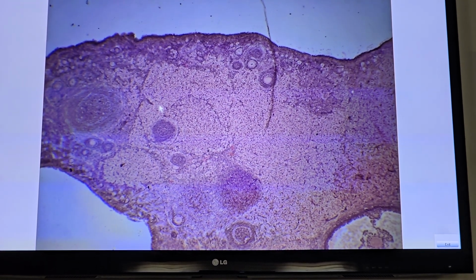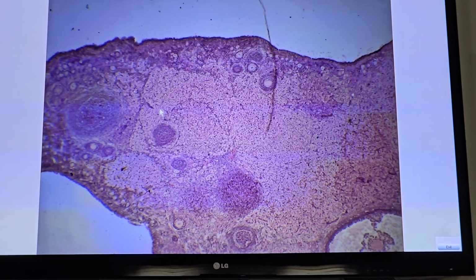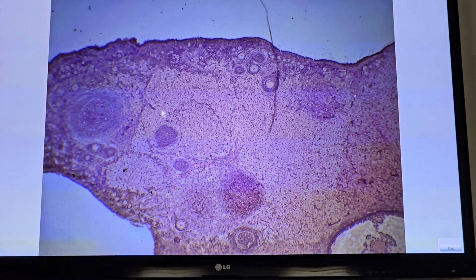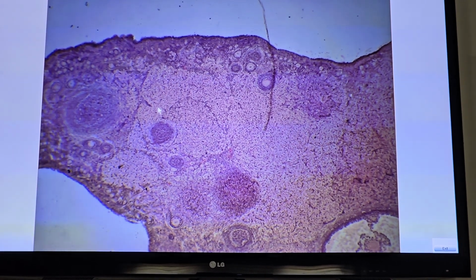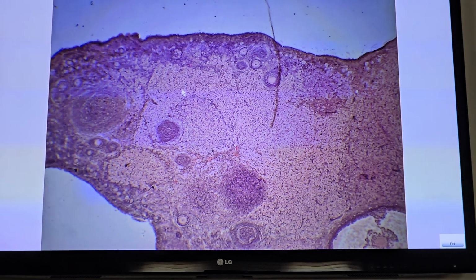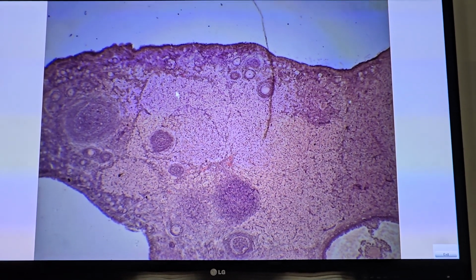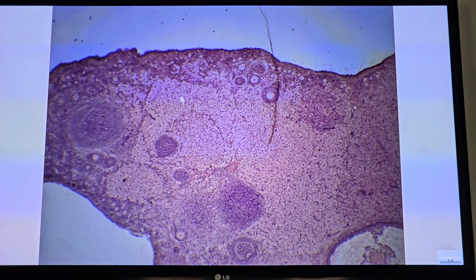Today I will examine the parts of the female reproductive system and the mammary glands. The female reproductive system consists of the two ovaries, the oviducts, uterus, cervix, and vagina. This is like the section in the ovary. Each ovary has almond shape.